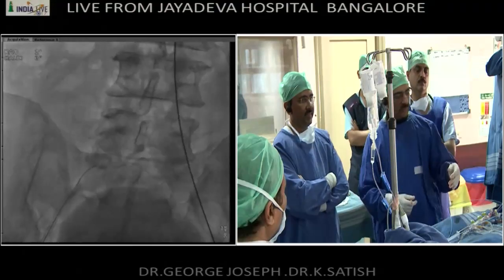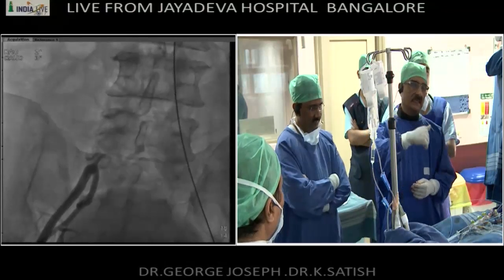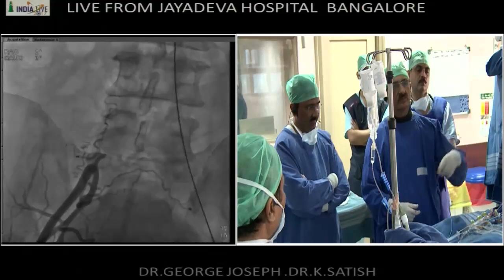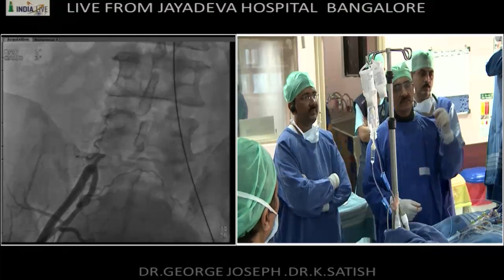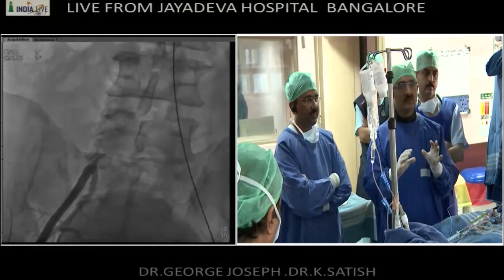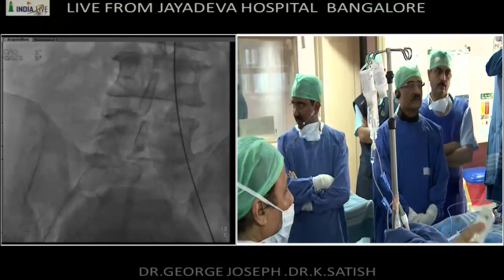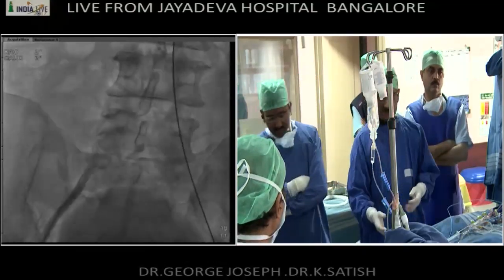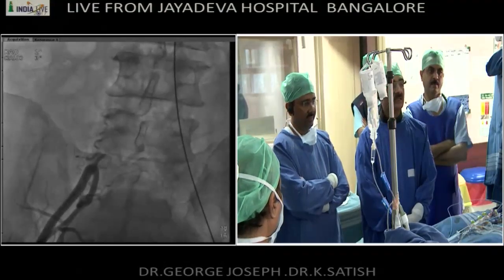I have two options. One is to come from the left femoral and use a Judkins right and work contralaterally, or if that's not helping, I can come from the brachial and enter the CTO from above so that we don't raise a flap in the terminal aorta. Almost 90% of my recanalization is with a Terumo 035 hydrophilic wire, angled.